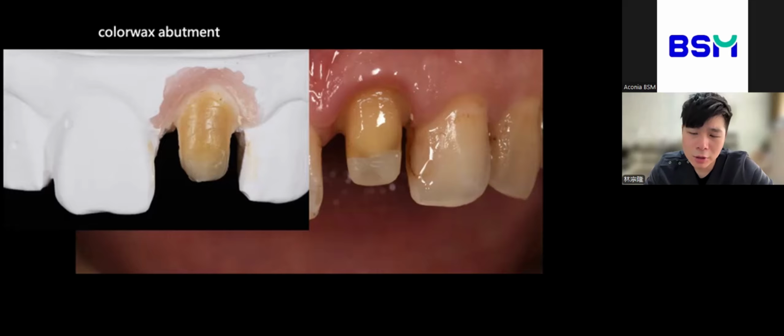So that's why single tooth match cases are considered the most difficult for technicians. Even though it's just one tooth, you need to verify the shade again and again. Sometimes multiple rounds of checking are needed to get a truly accurate result.